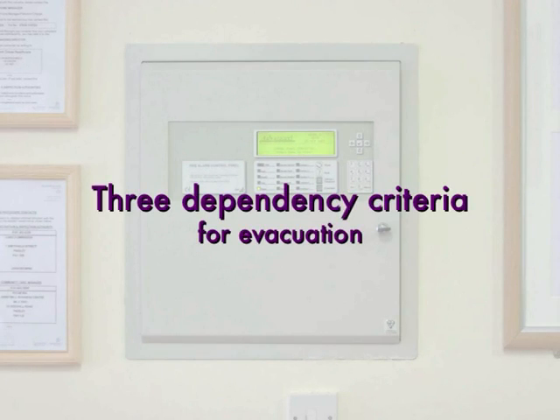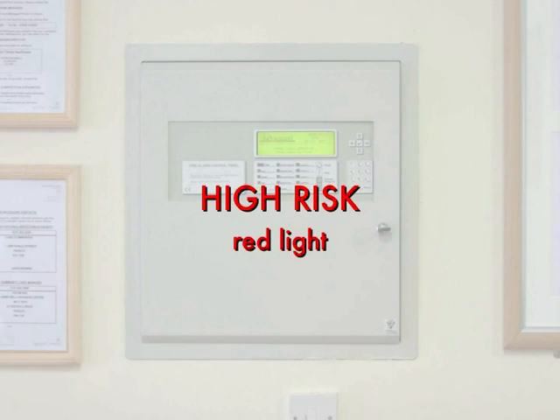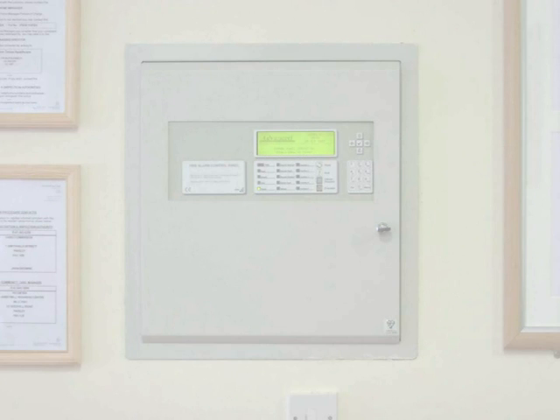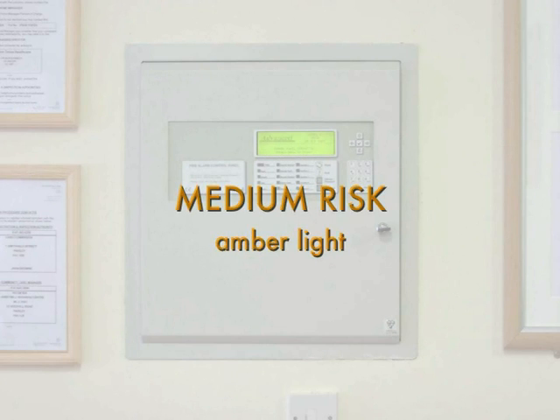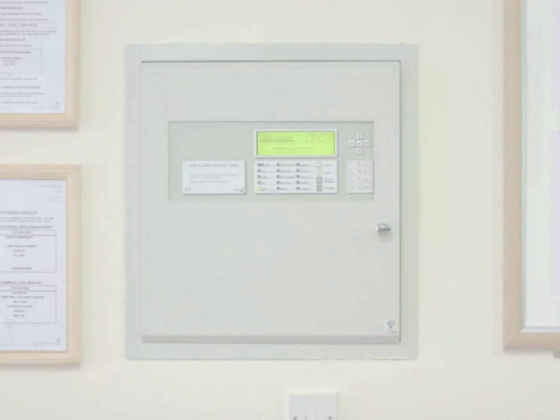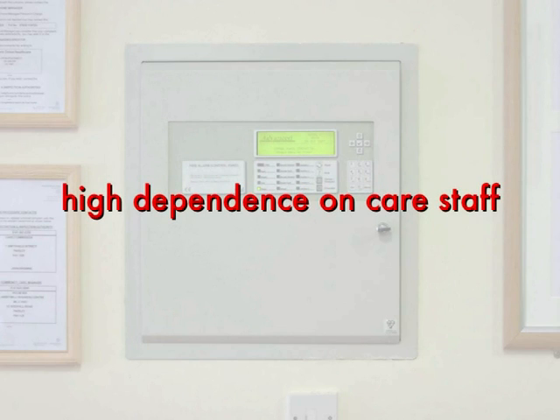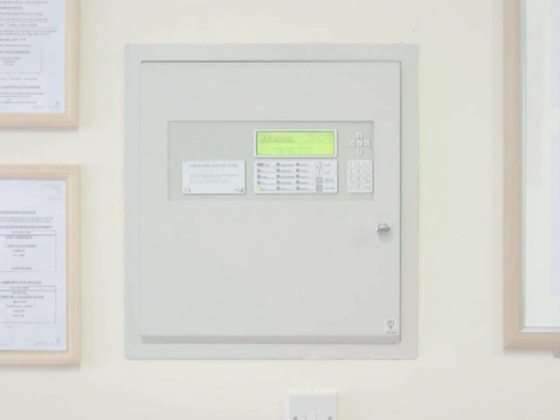There are 3 dependency criteria for evacuation. High risk criteria, or red light, medium risk, or amber light, and low risk, or green light. The high risk criteria service users' care or condition creates the high dependence on care staff to assist with all aspects of their activities of daily living, and without assistance, to evacuate them would prove potentially threatening.